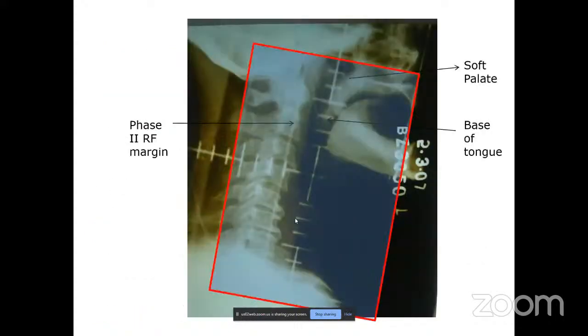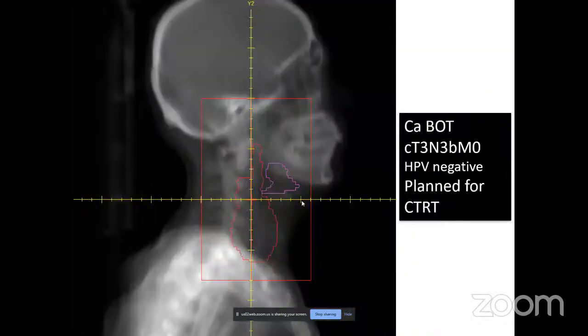So this is a typical radiotherapy portal for an oropharyngeal carcinoma. This patient has had a base of tongue tumor, so the patient needs radiotherapy to the primary as well as the neck nodes. The neck nodes included were 2, 3 and 4, and I'll discuss the borders later here. So this is the case of carcinoma base of tongue.